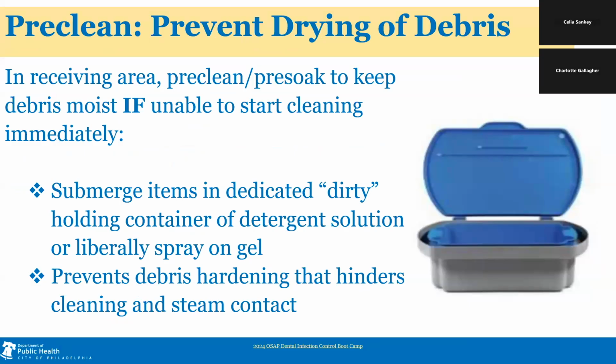On entry to the first area, the decontamination area, instruments may be placed in a dedicated pre-soak container to prevent drying of debris when they are unable to be placed immediately into the ultrasonic. Remember, any dry debris or biofilm on instruments will prevent steam contact later when they are placed in the sterilizer.